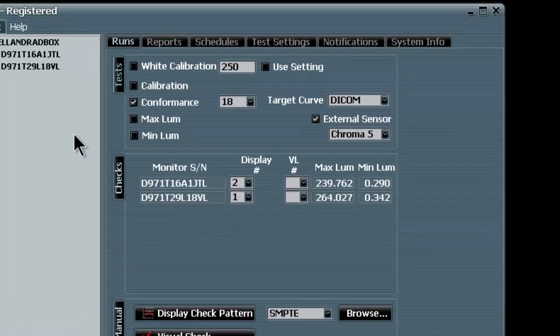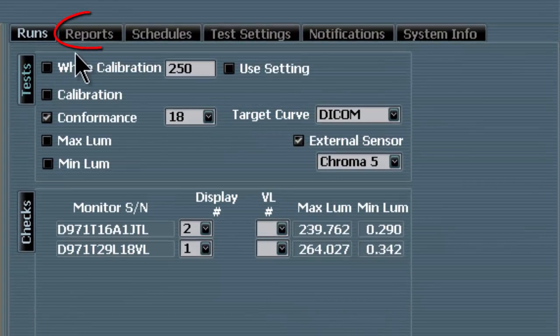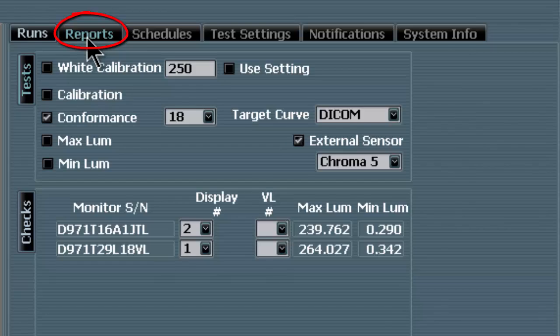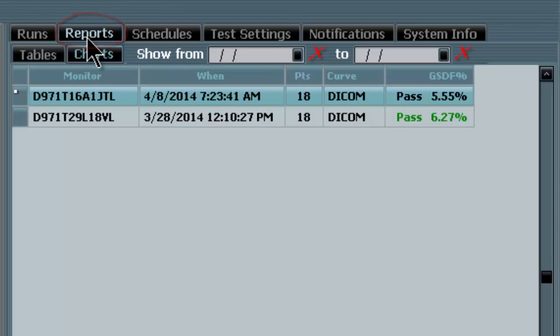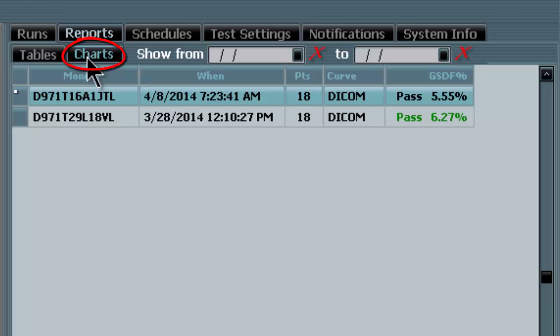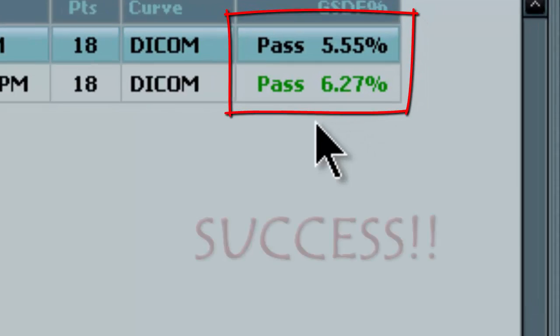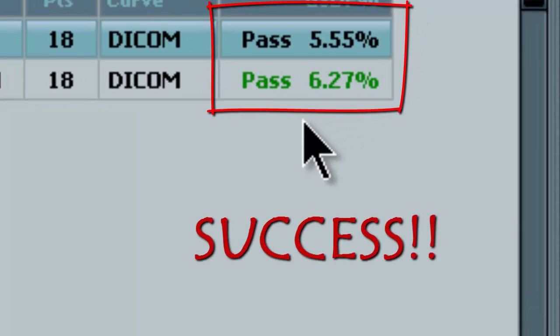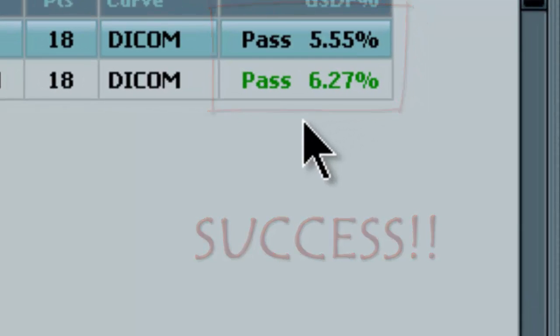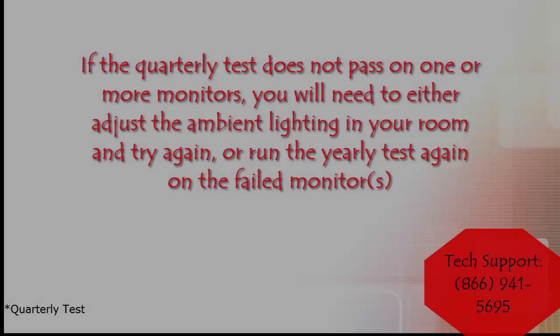With the final test complete, we are returned to the main menu. At this time, we click on the Reports tab at the top of the menu. Then we click on the Charts tab to reveal the results of the testing. Any result showing 10% or less is a pass. If both monitors have passed, you may now exit the test and enjoy the rest of your day.